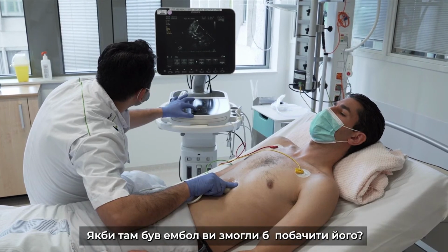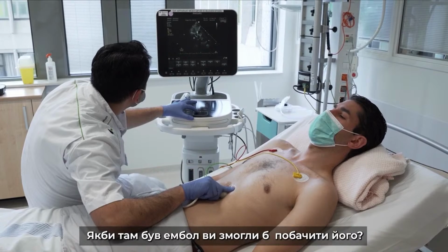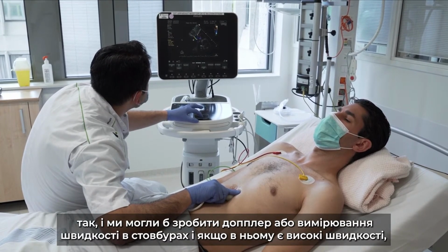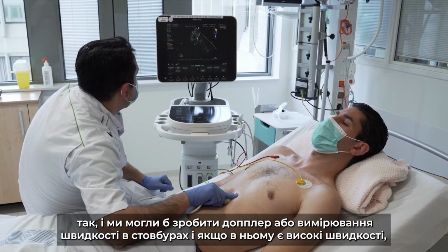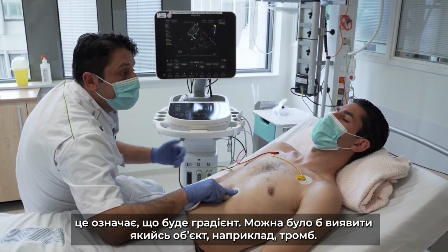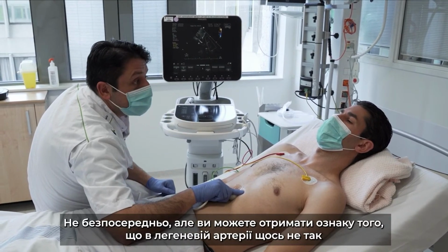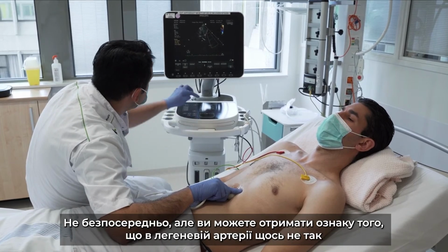If there would be an embolus there, would you see it, Zakir? Yeah, you can see a sign, and you can do a Doppler or velocity measurement in the truncus pulmonalis, and if there are high velocities in it, then that means there will be a gradient in it. So some object like a thrombus can be detected, or not directly, but you can get a sign that there is something wrong in the pulmonary artery.